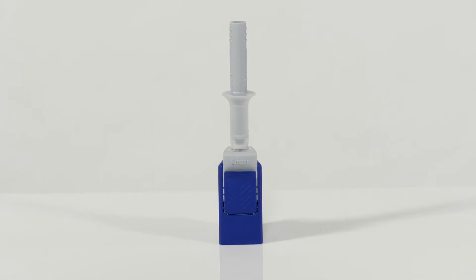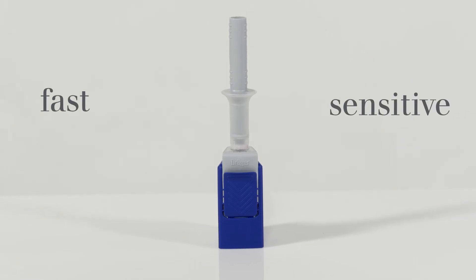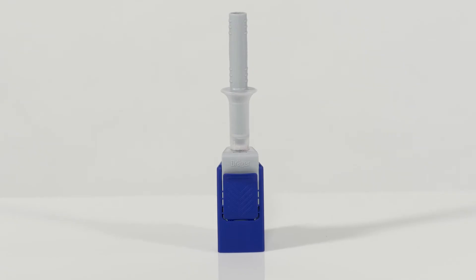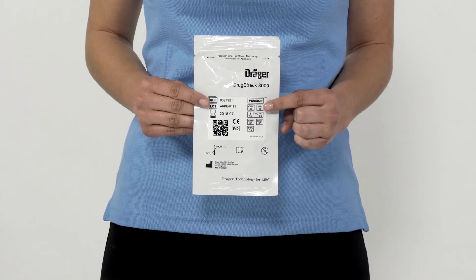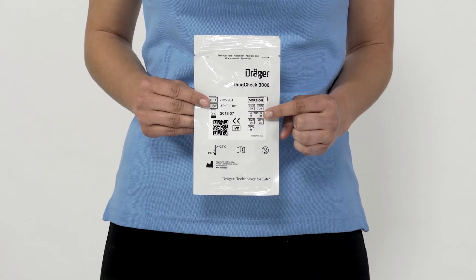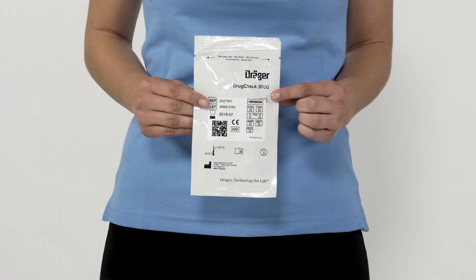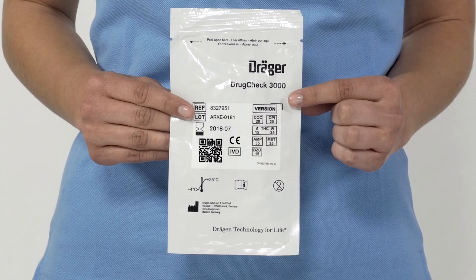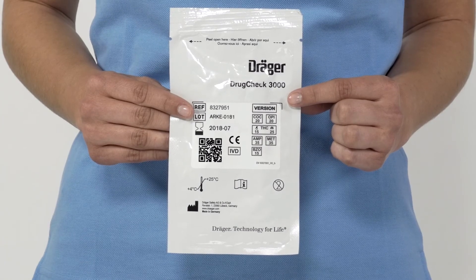The Dräger Drug Check 3000 enables you to choose between a fast or sensitive measurement to prove the presence of THC. The respective waiting or pre-incubation time must be strictly adhered to. Full information on wait times for THC testing, as well as limit values in nanograms per milliliter for all substances, can be found on the Dräger Drug Check 3000 packaging.